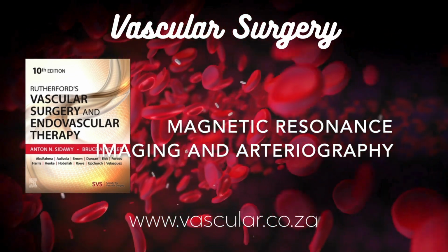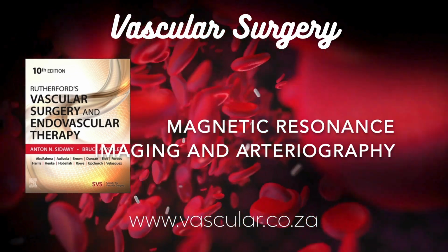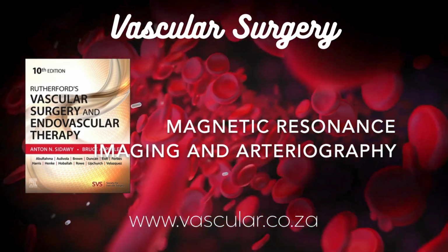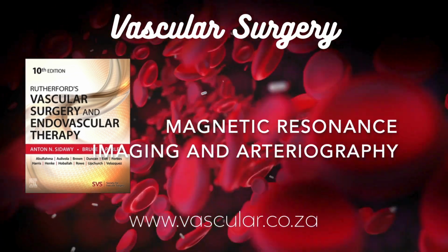It might even be better than catheter angiography sometimes because MRI is so sensitive to the signal changes caused by clot. So MRV is strong for veins. Yeah. How else is it used for venous problems? MRV is really useful for looking at the big central veins, like the superior vena cava near the heart, and also the deep veins in the pelvis and legs.